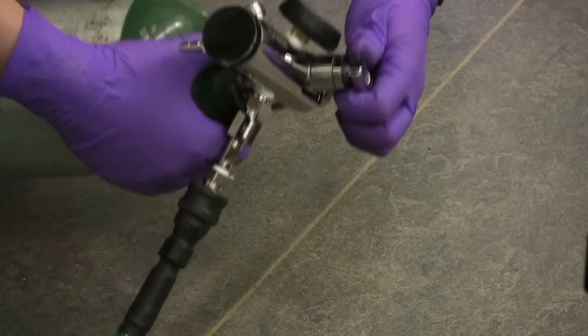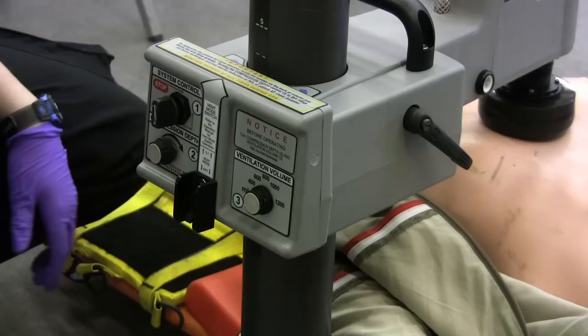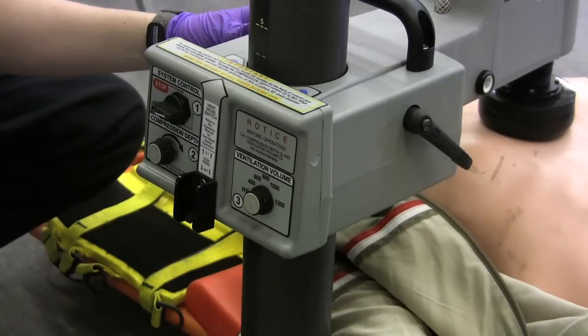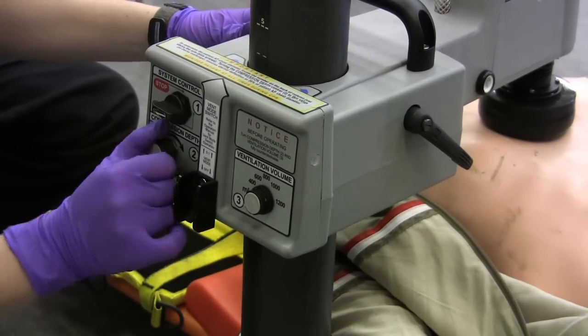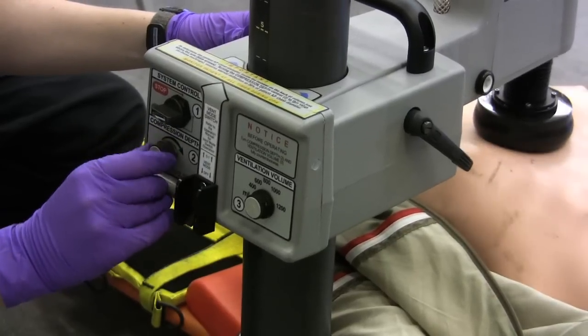Now that we're in place, we're going to turn on the oxygen. To start compressions, you're going to come to system control and turn it to run. Then you're going to increase the compression depth by turning the knob clockwise, and you want to go until you reach that four-and-a-half mark.